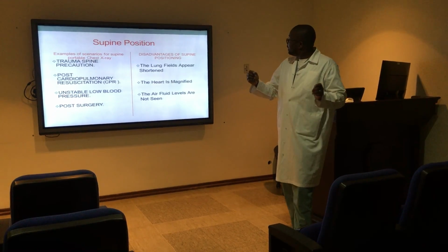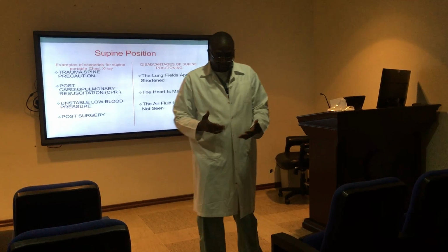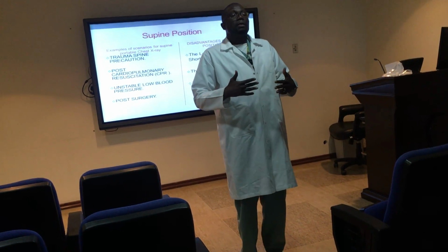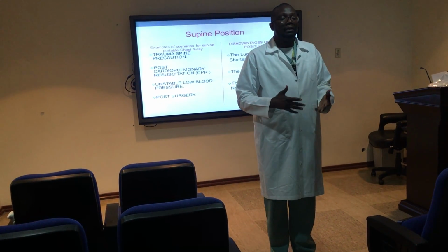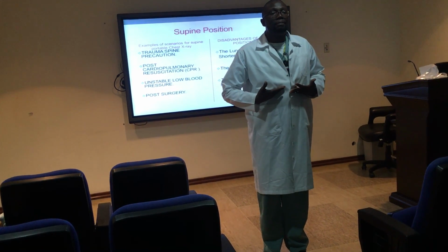First, the lung field most of the time will be foreshortened. It will be small. Imagine lying down, supine. What happens? The abdomen pushes the lungs up.